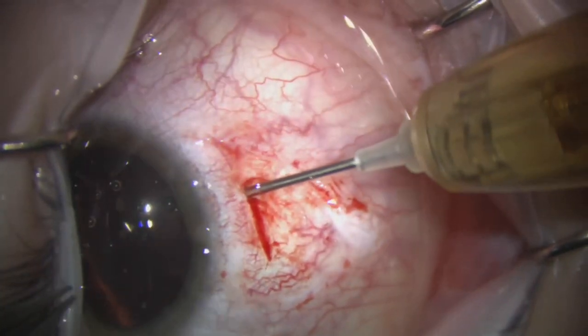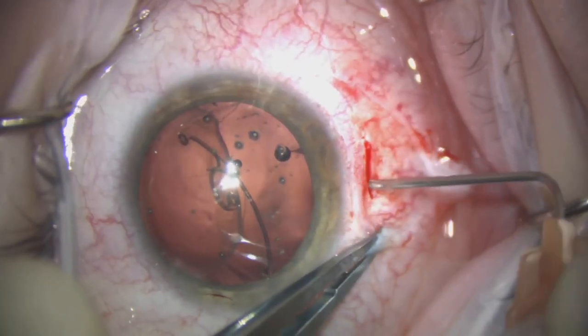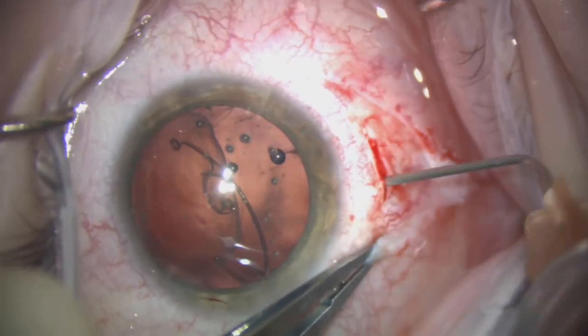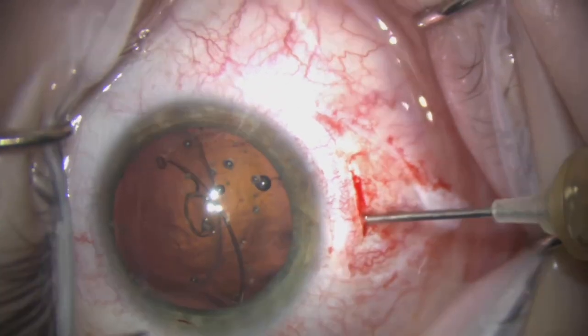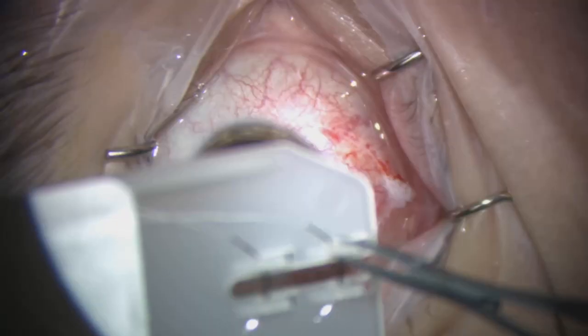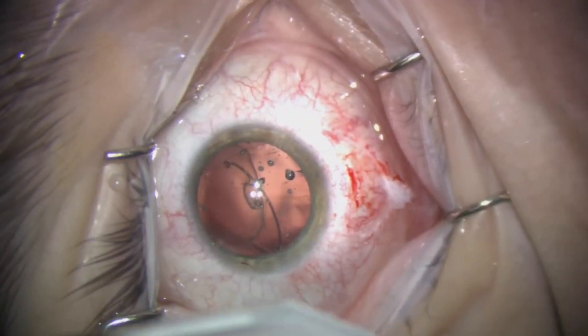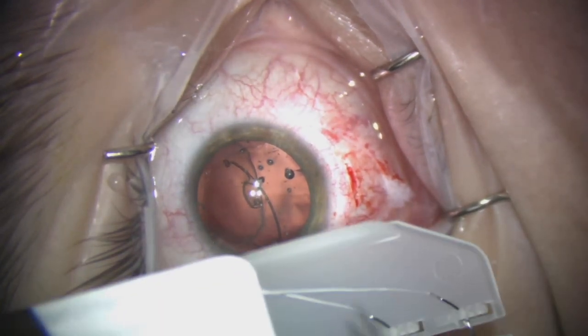I like to follow the needle track with a micro grasper to really allow us to control the exteriorization of the Gore-Tex. I don't like to dock the needles into the 25-gauge needle, as I don't think this gives you enough control.